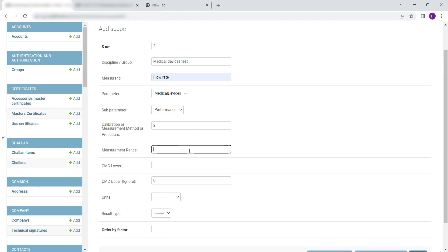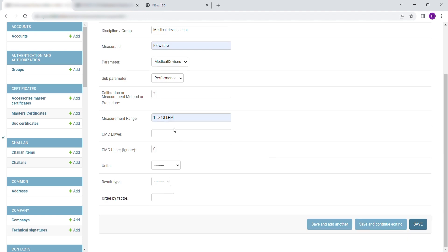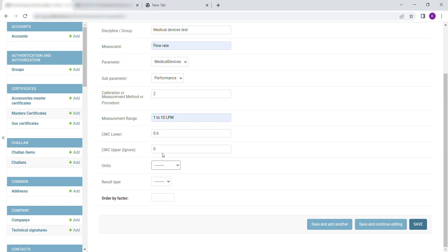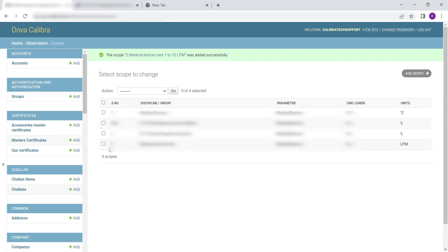Select Medical Devices from the drop-down. Select the sub-parameter. Enter the lower CMC value. Select the units. Click on Save to save and exit, or Save and Add Another to continue adding scopes.